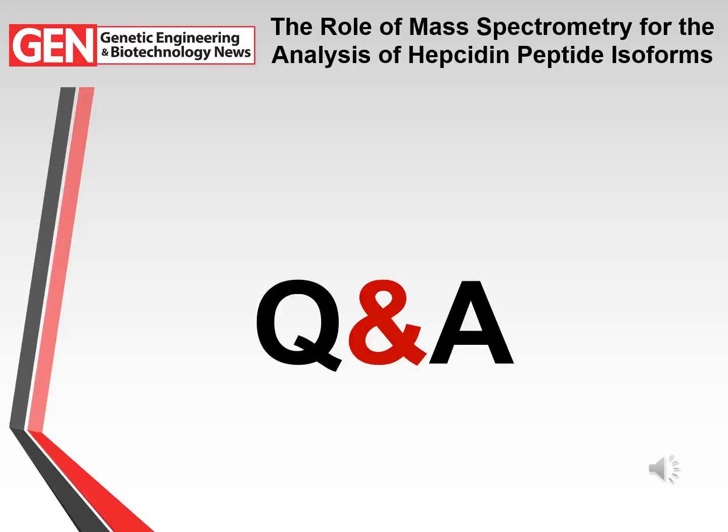Yeah, the Hepcidin has actually been very challenging. We've also had some benefits in that we have colleagues who are able to provide samples who suffer from hemochromatosis, so therefore have very low levels as well. The big challenge is making sure that we have large enough samples so that the stickiness of Hepcidin doesn't become a problem in terms of low recoveries or getting the answer wrong. That's very, very important.